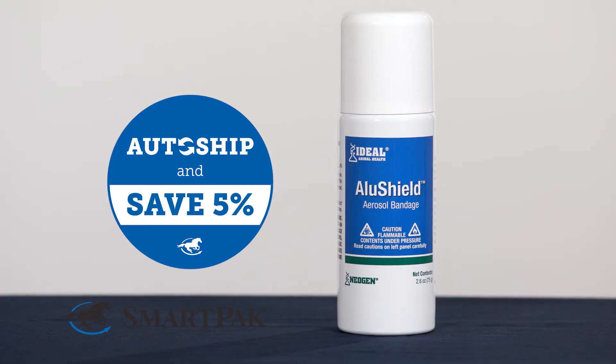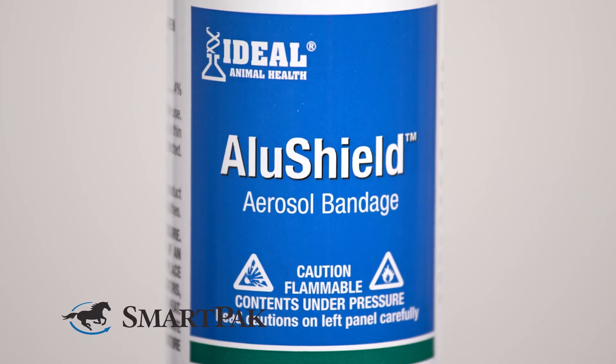This is a super handy spray that helps protect wounds from dirt and debris while still allowing them to breathe. It helps to promote healing while also being very simple to use.